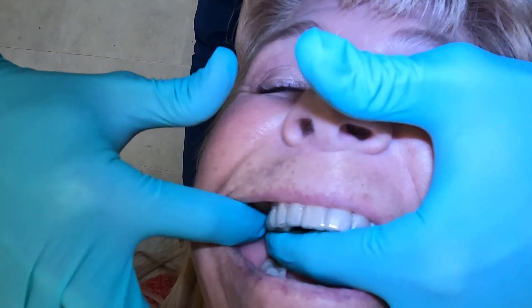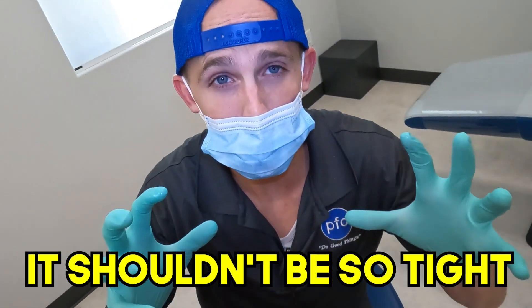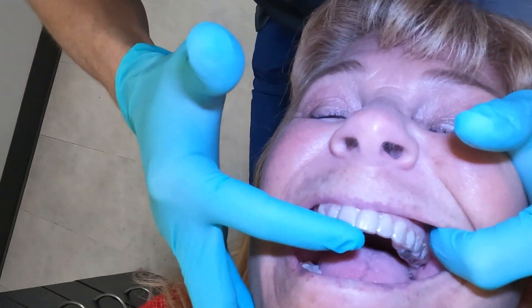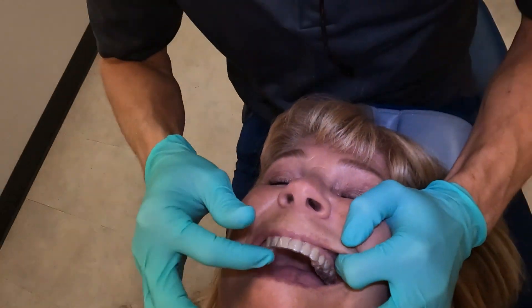Watch out for your cheeks and lips in the back. The fit should be nice and snug, but it shouldn't be so tight. Sometimes if you wait too long before you get the retainer in, it's gonna be really tight and hard to get all the way down. A good retainer should fit well but be mostly passive, so you can pull it out without too much force. This is the way we like ours to look when it's in — hardly any space, flat up against those teeth.